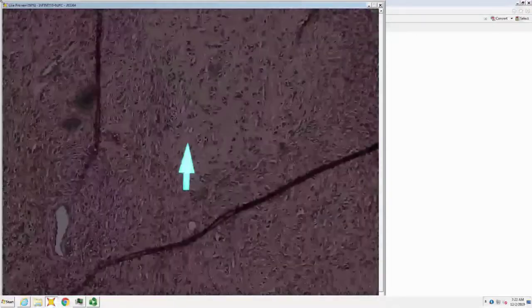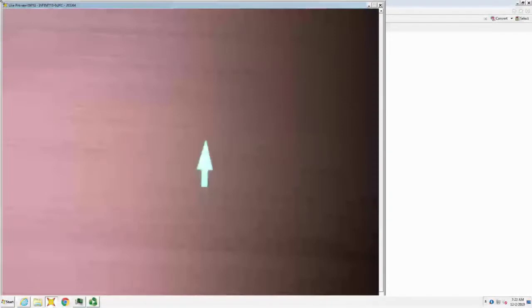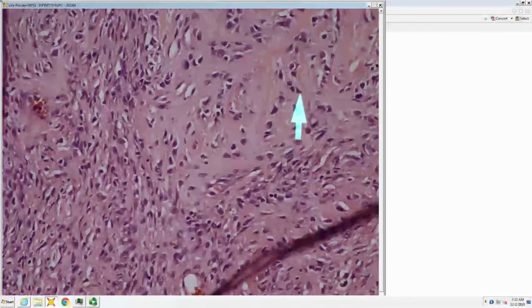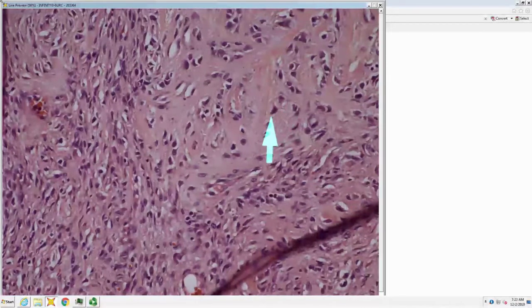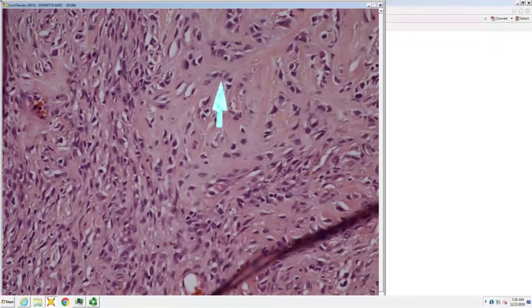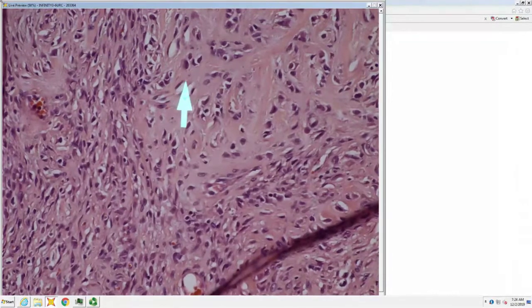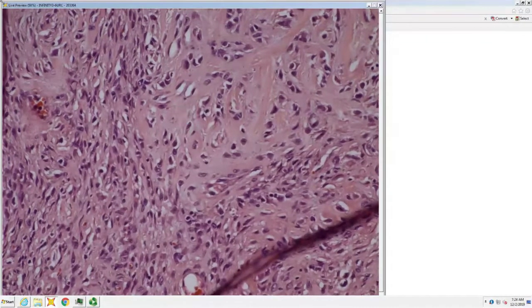And then do you know anything that's a cousin to a dermatofibroma that has these pyramid-shaped, stellate cells? The pleomorphic, right? Or no? Well, pleomorphic has them, but they tend to be hyperchromatic. The other one, angiofibromas have them, and epithelioid histiocytomas have them.